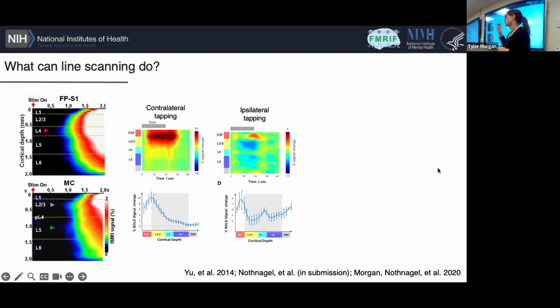What's really interesting is that if you then look at the ipsilateral side, which is the analog of the feedback that we're looking at, you can see something pretty cool: you no longer see just a massive peak that's overwhelming the entire signal coming from outside of cortex. You can see dynamics from within cortex as well. Specifically, in motor cortex, you can actually see a peak. And by peak, I mean it stays the same while everything else drops, which is cool.